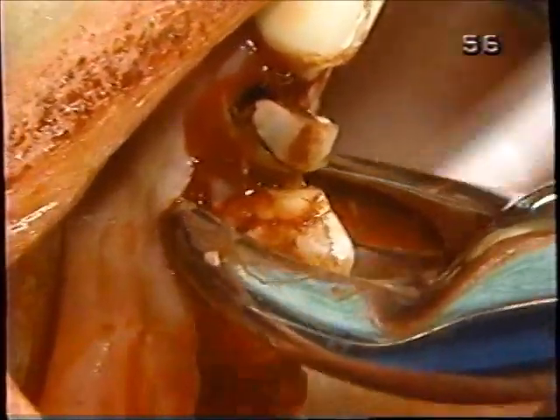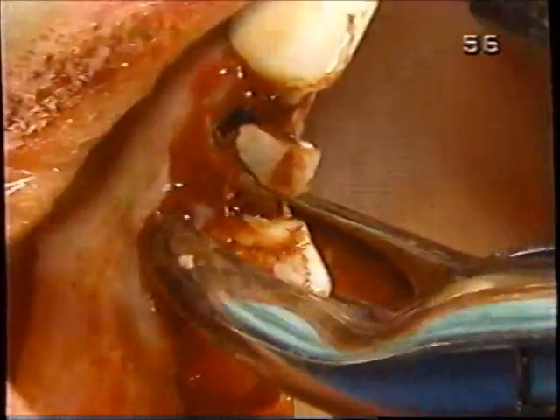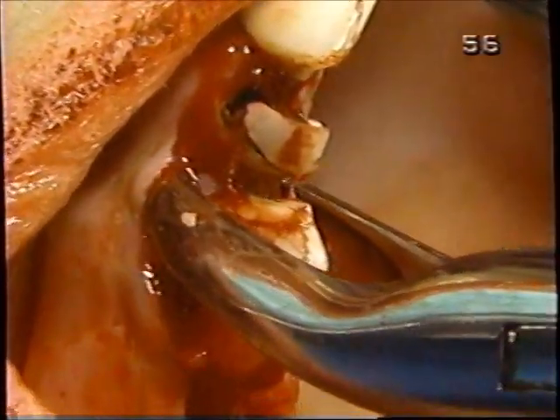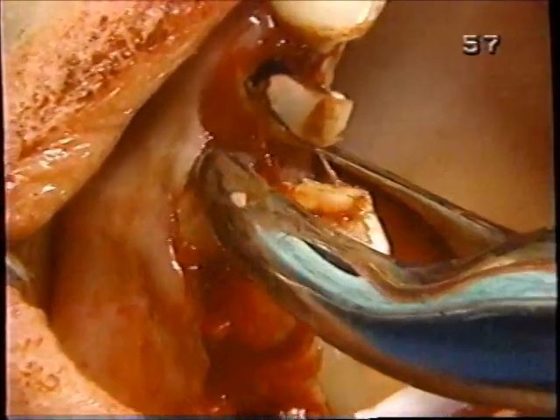It's common also to fracture some of the facial bone, causing sharpness and necessity for rongeur and a lot of bone trimming and bone loss here. Look how long that root is.